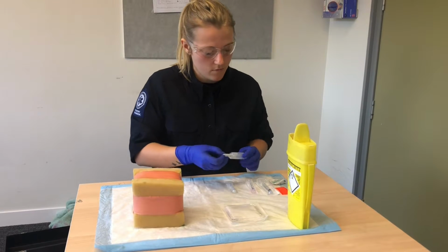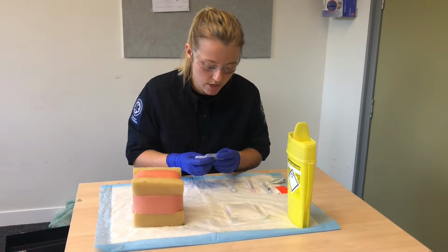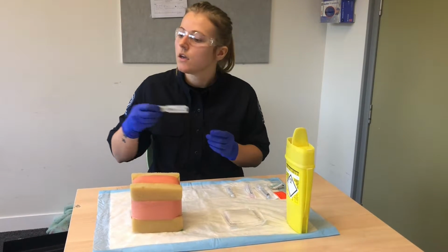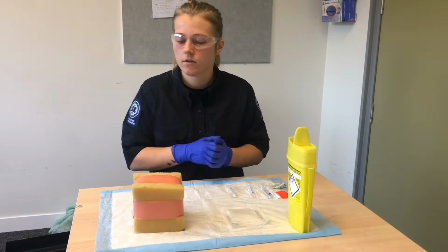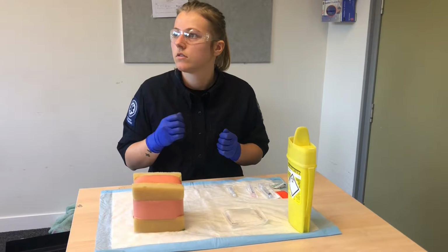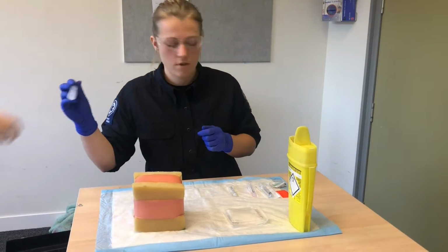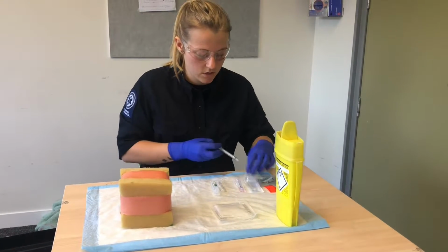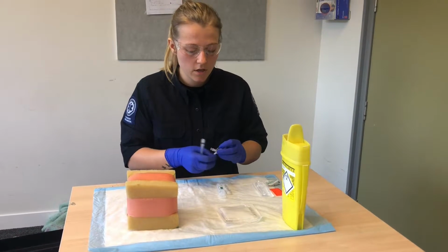And also I've got my lignocaine here, so I'm just going to drug check. 1% lignocaine, expires July 2020. Ty, can I just get you to check that for me? Yeah, 1% lignocaine expires July 2020. Awesome, thank you. And I've also got here my 3ml syringe and my drawing up needle.